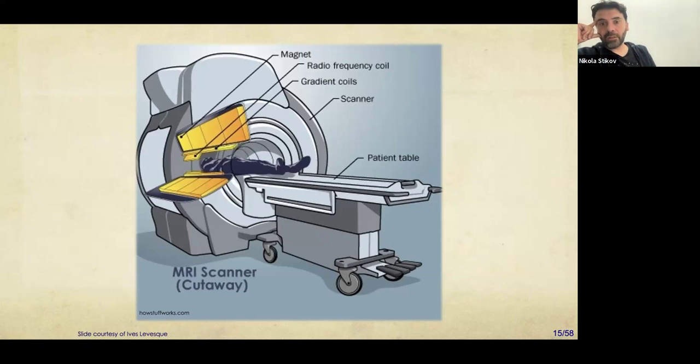So regarding the breakdown of how everything is being used, the radio frequency coil and the gradient coils can be replaced. But the main magnet, if it quenches, meaning if the helium evaporates, then you can no longer repair the scanner. It's pretty much ready for the trash.